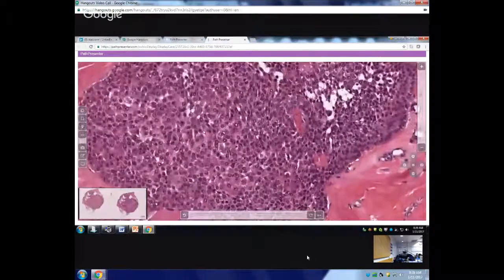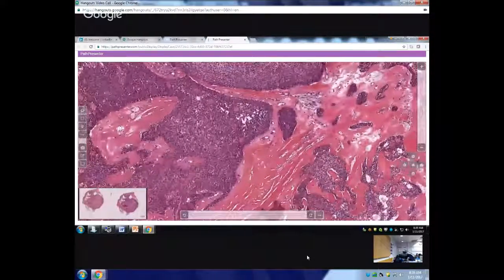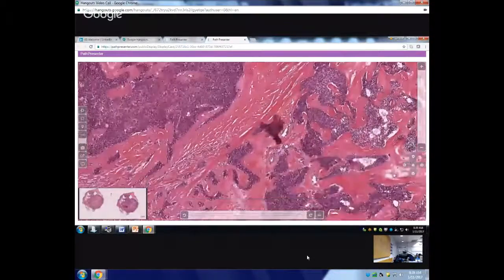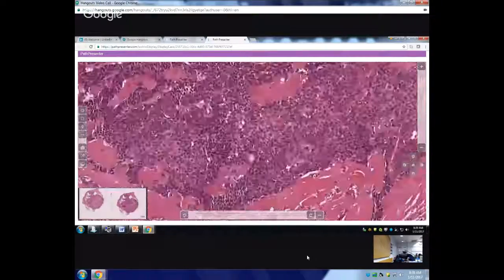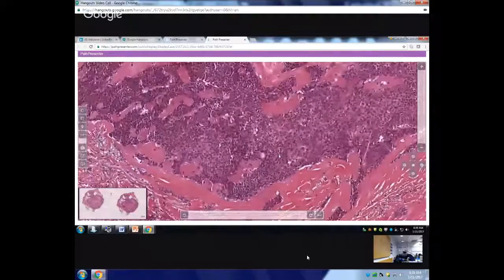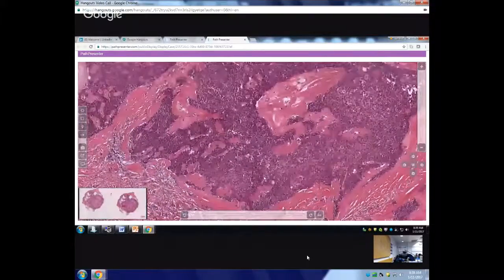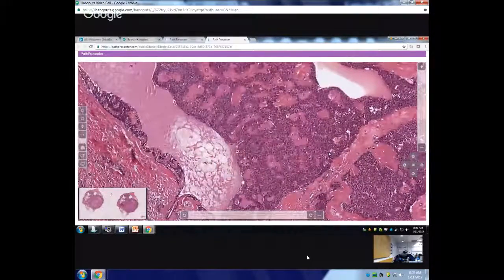If you go through the whole lesion, you're definitely going to find the ducts actually. But look at the stroma, very, very sclerotic. And if you don't see the ducts, you can always do a CEA, and the CEA is going to highlight the ducts actually. But if I look at this very carefully on high power, I'm definitely going to find the ducts here.